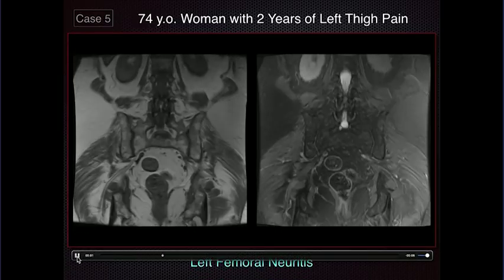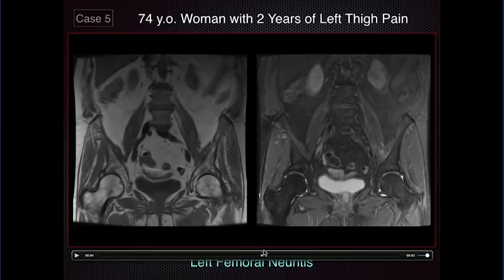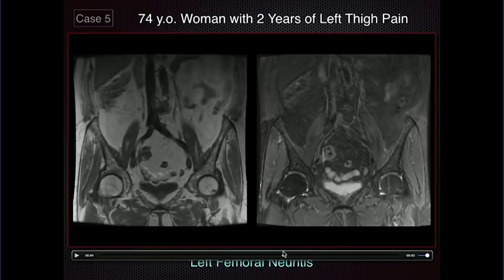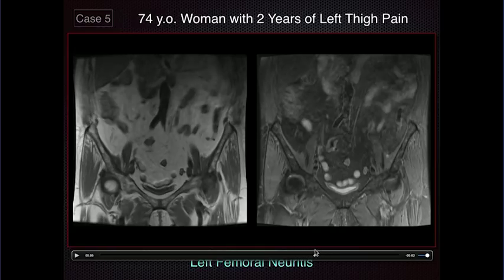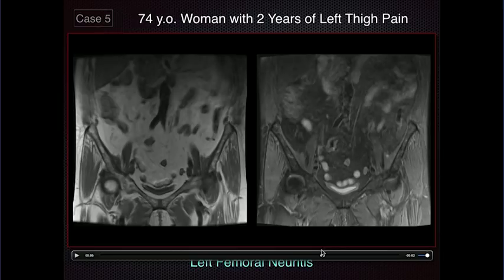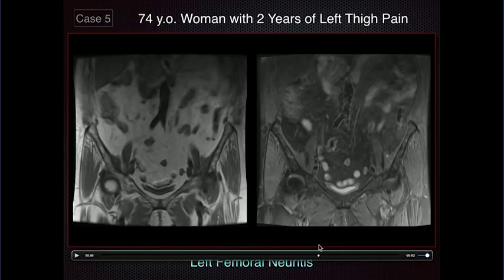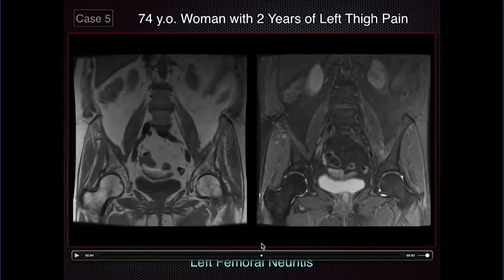In practice, we obtain both coronal T1 and fat-suppressed T2 2D images, but also a 3D sequence that has images with and without fat suppression. Looking at the left femoral nerve here, as I scroll up and down, you can see the femoral nerve is a little bit hyperintense compared to the one on the right side. This is thought to be a femoral nerve abnormality — whether a true neuritis or not we don't know, but it could definitely help explain some left-sided hip region pain.